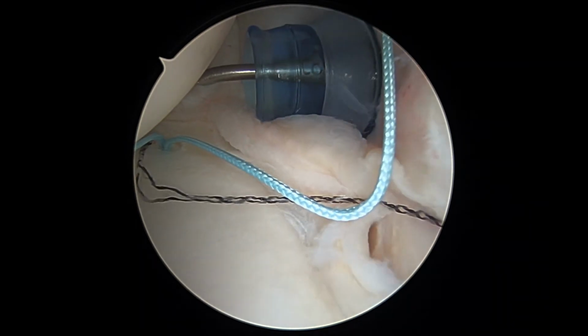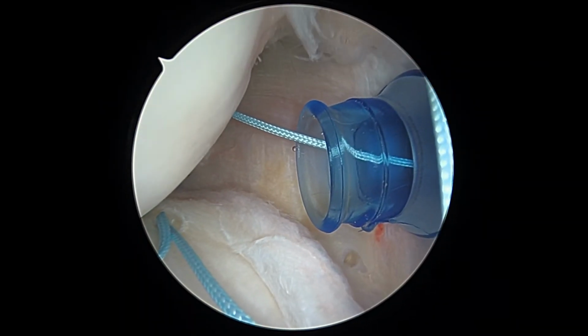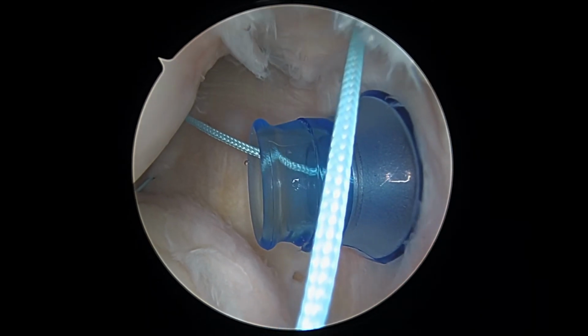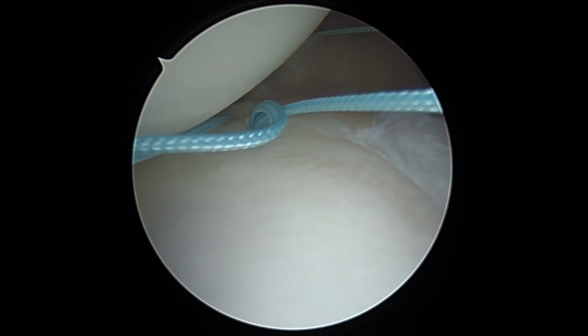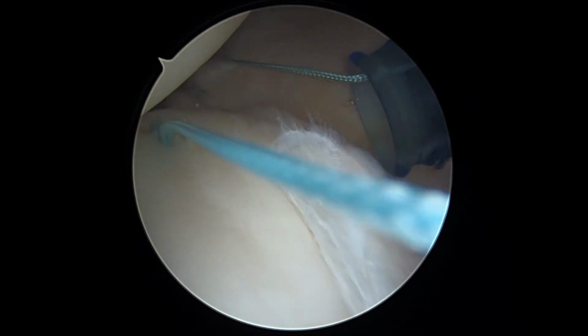So now outside your shoulder, we're going to load that with a stitch. Just pull back on it. Okay, so grasper. So here you can see how that blue suture is now coming through the capsule. And if you watch here, you'll see the rest of it go underneath, just like that. I like the way that looks.